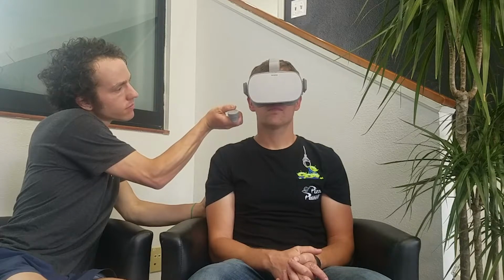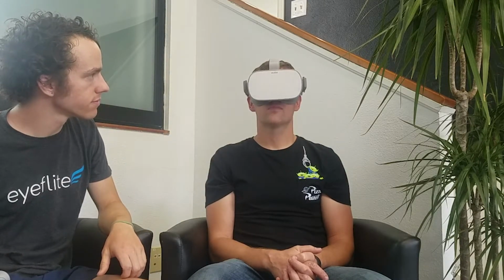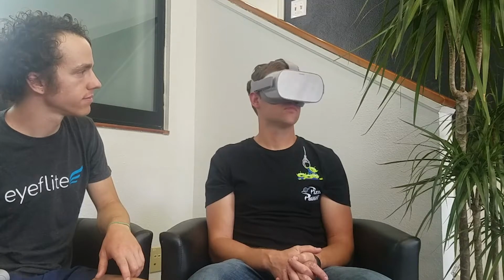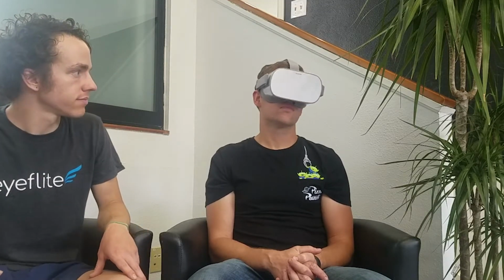Align the controller with the headset and hold down the Oculus button for about 2 seconds. This wakes up the headset and centers the display. Now the headset is in hands-free mode and you should put the controller aside. While using Eyeflite Ava, everything is controlled with head movement. The handheld controller should not be used.